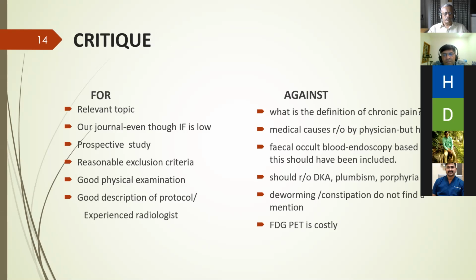The first point for this study is that it is a relevant topic, and even though the impact factor is low, it is our journal, published in the Indian Journal of Surgery, and it is a prospective study. A reasonable exclusion criteria is there, as I mentioned earlier, and good physical examination and good description of protocol, and the PET CT reporting is done by experienced radiologists.